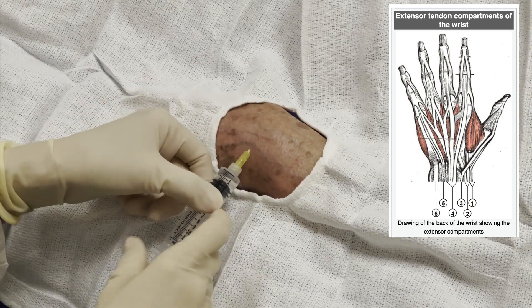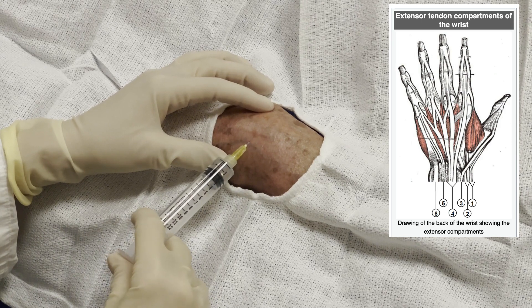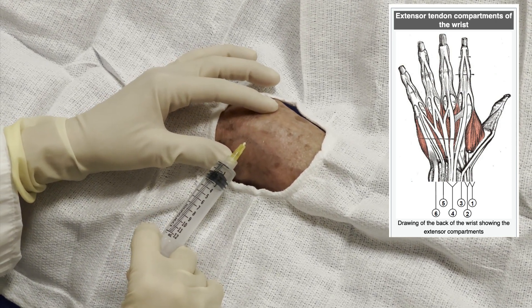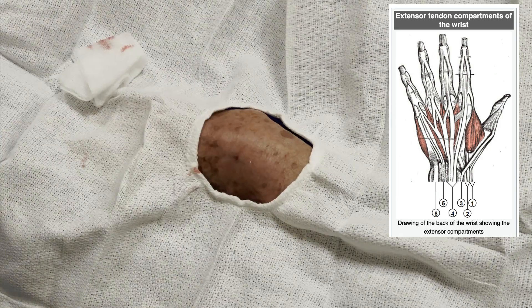I use one percent lidocaine with epinephrine here. You'll see the little wheal that shows up as I place anesthesia under the skin right over the fourth compartment.